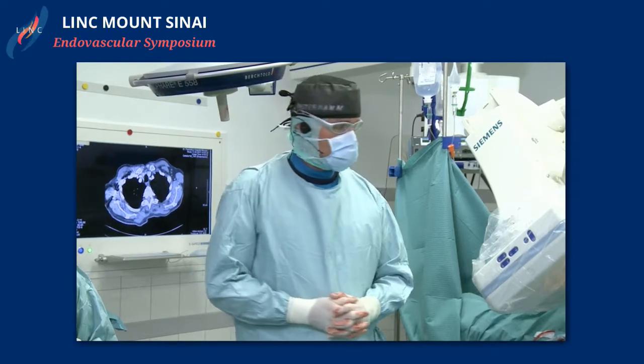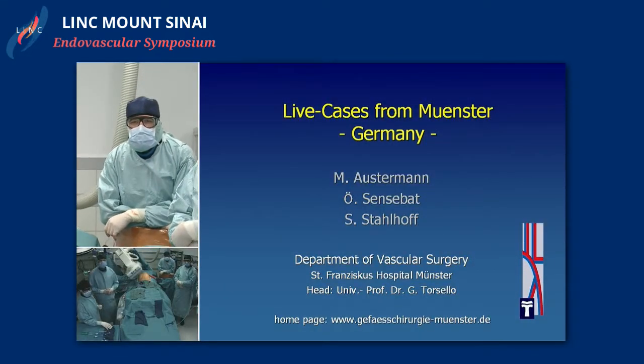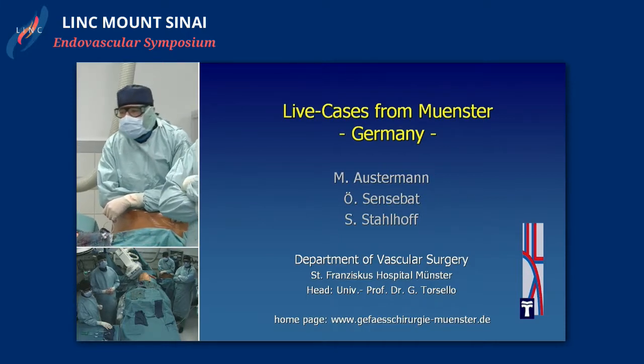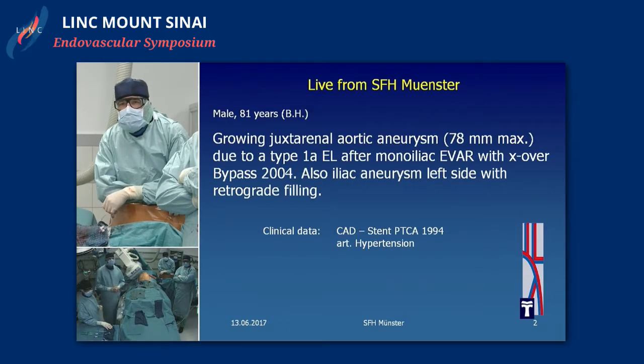So, hello to New York. We're going to treat an 81-year-old male patient here. The next slide, please. The patient has been treated by EVAR with a Talent endograft 13 years ago.